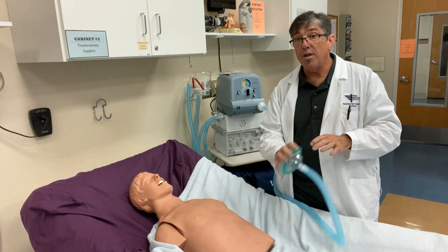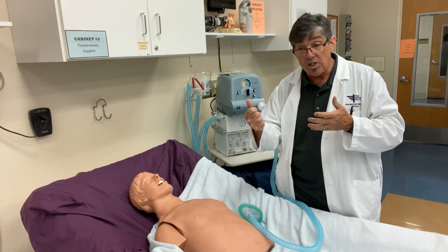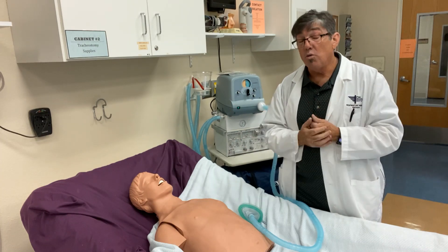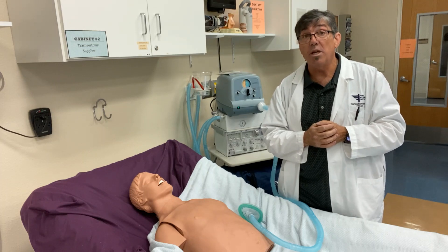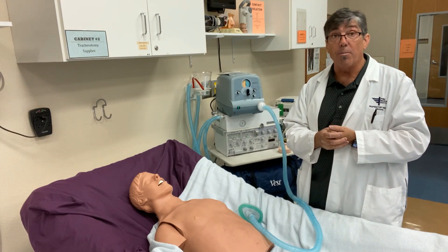I've seen with endotracheal tubes or trachs, when we draw and hit the exhalation side, the patient's secretions are coming up. You should be ready to suction because the secretions will follow very quickly after you begin the cough assist therapy.